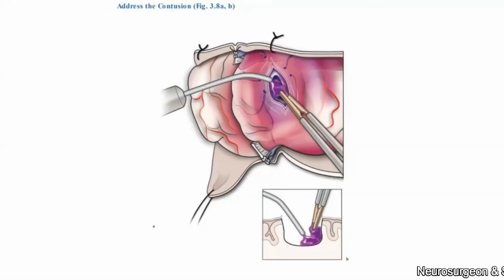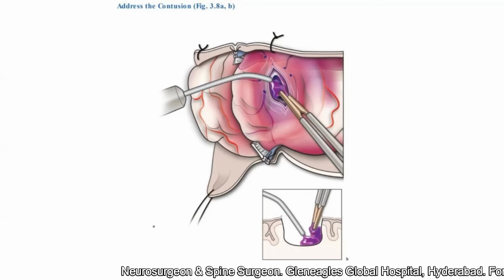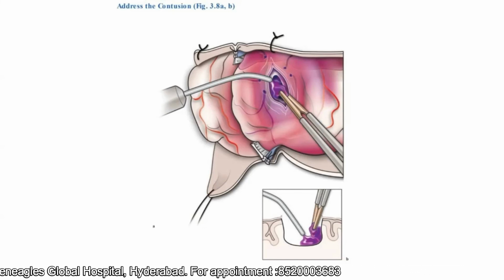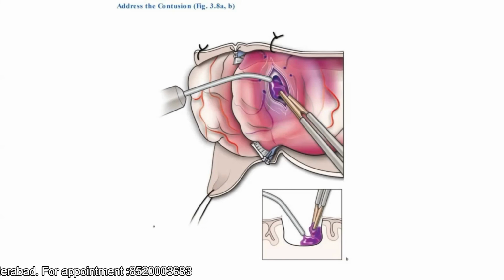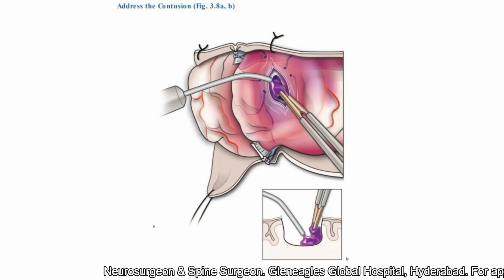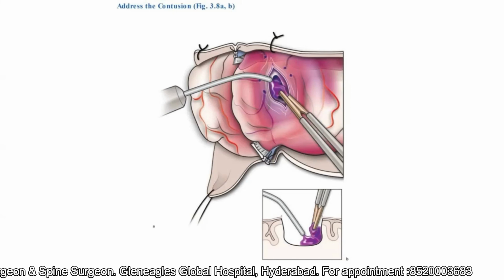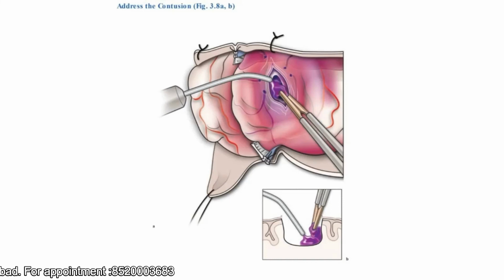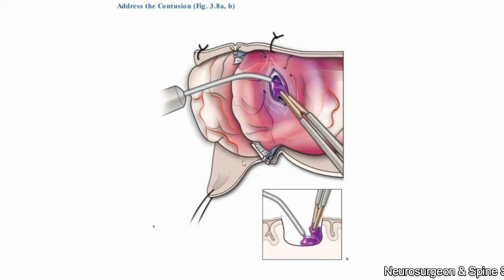Now coming to the evacuation of the contusion, this is similar to the evacuation of the temporal contusion in my previous session. So for people who have not attended my previous session, I request them to go back to my previous session on my YouTube channel. There I have clearly explained how to remove a contusion. It involves first identification of the contusion, cauterization of the superficial pial surface, then in the subpial plane reach the contusion, evacuate the liquid and solid components of the contusion, and achieve hemostasis.